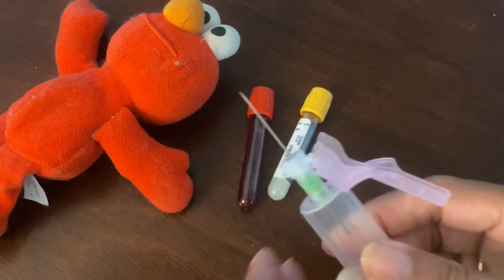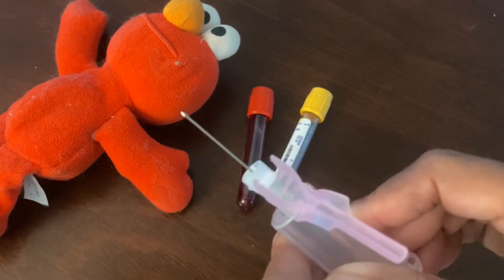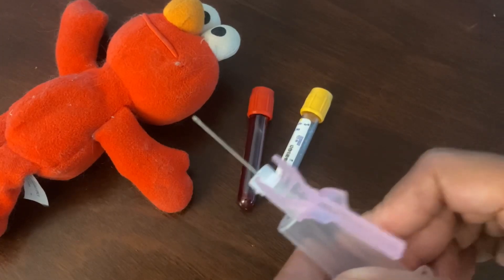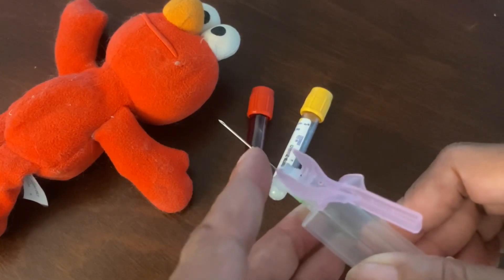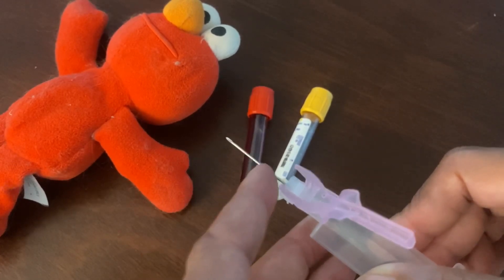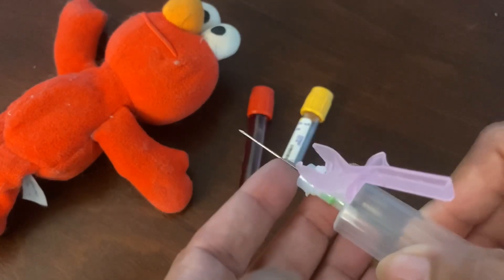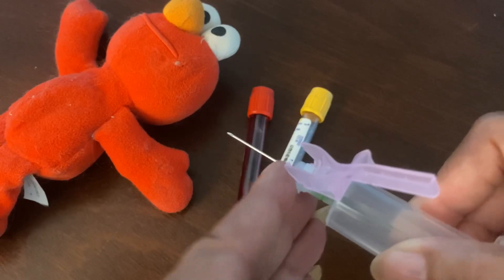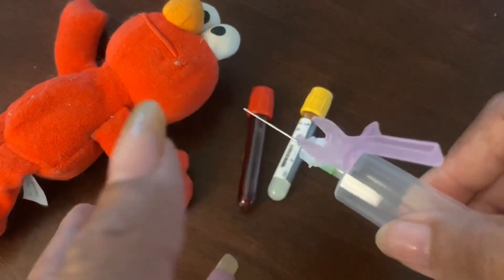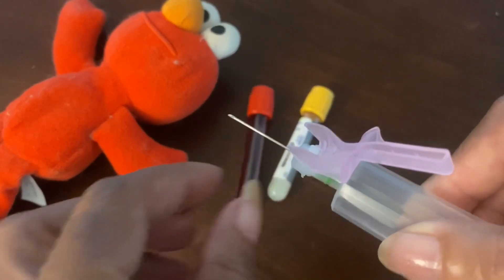Your butterfly needles are not this long. And like I said, it's not that you have to put it all in the arm, but if you have a deep vein, some people have seen me stick several times and because they didn't know anything, they were like, oh my gosh, you got the entire needle in the arm — because it's a deep vein. That's why sometimes if you see a butterfly and it looks like all of the needle is gone or you don't see it and it's in the arm, it's because it's a deep vein and the butterfly needle shaft is shorter.